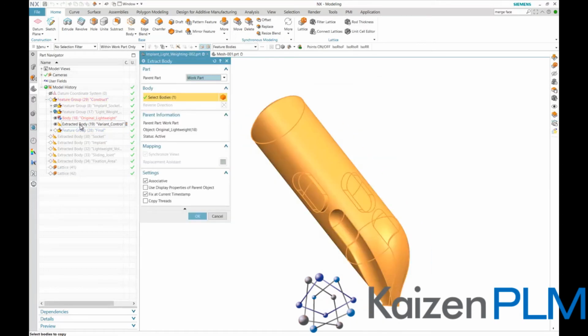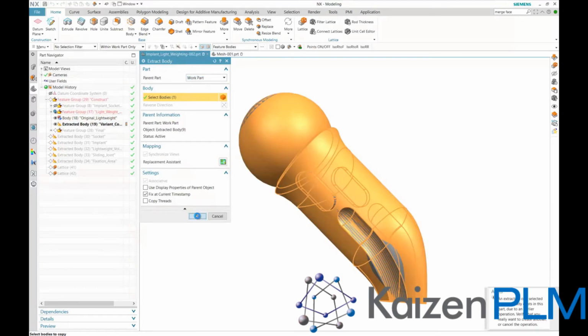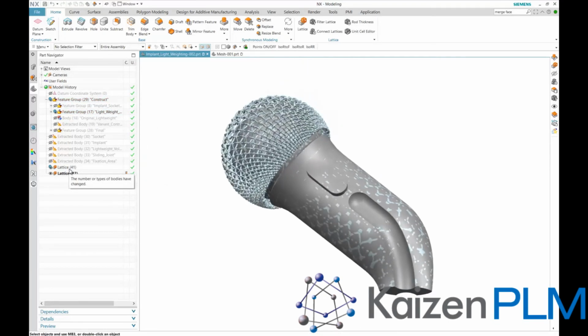By redirecting the associative extract feature defining the volume boundary of our lattice and pointing it to the already prepared volume associatively following the outer shape of the implant, we show that the lattice from this release of NX is an associative feature. Really good news for automating all the customer processes out there.